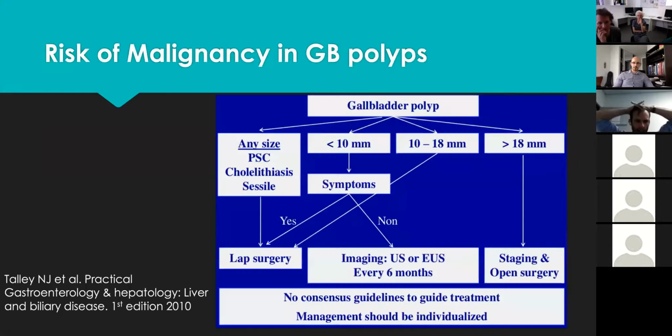There's no common consensus on how to deal with the polyps, but we could find this kind of pathway which makes sense. Again, I don't know whether this would be the sort of question that they might ask you, how to deal with a polyp. But technically, I would imagine if you see a polyp, it wouldn't be a cause for any sort of ICU admitted patient. So I assume logically they wouldn't expect you to know that sort of thing. You would just ask for gastroenterology.